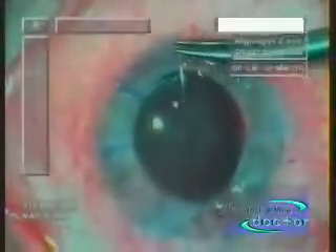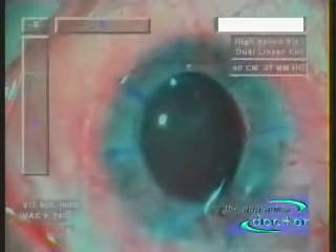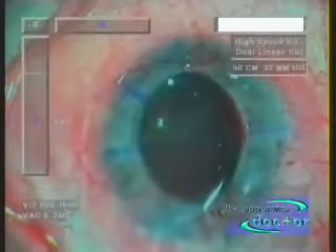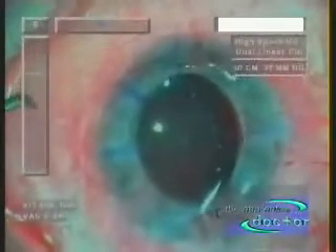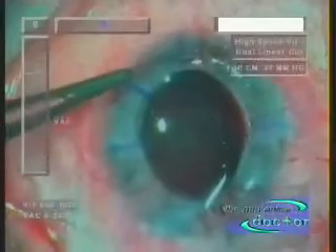The first suture bite goes through the donor cornea, and the second bite through the remaining cornea of the eye. The eye surgeon uses a modified surgeon's knot — three throws in one direction, followed by a single throw in the opposite direction, and then another throw in the original direction.